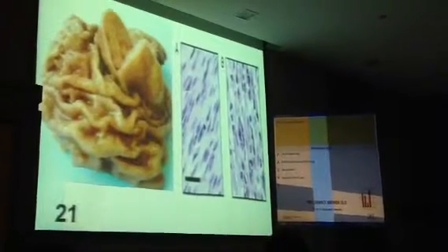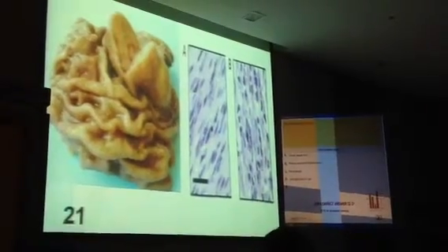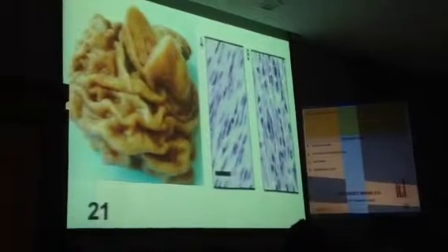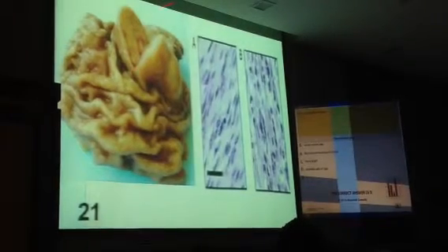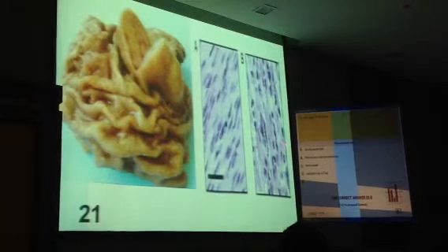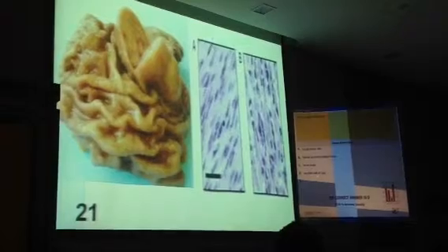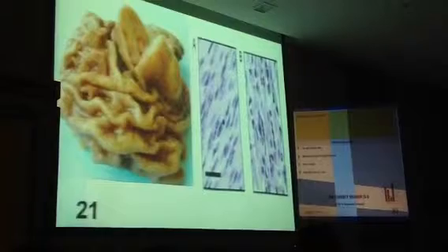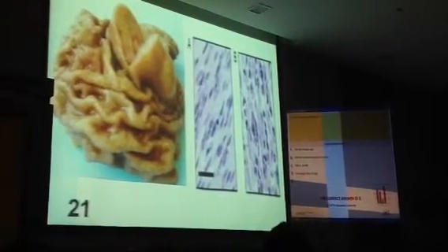This is gastrointestinal stromal tumor, also called GIST. This is a lesion of stroma. Okay, that's why gastrointestinal stromal tumor. So it's not epithelium. And if you see this, it looks like spindle, like smooth muscle, but by immunohistochemistry they have not been found to be smooth muscle, but rather they have histogenic appearance derived from interstitial cells of Cajal, which is the responsible cell for peristalsis. Okay, so this is the correct answer.